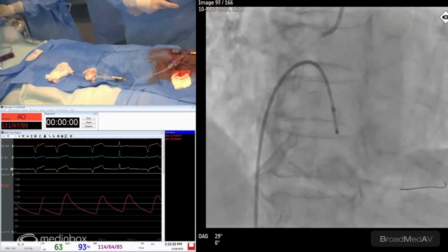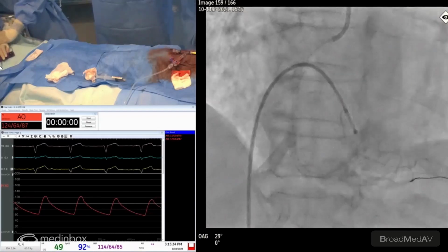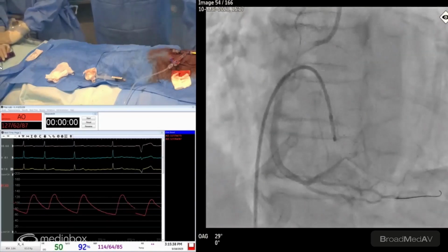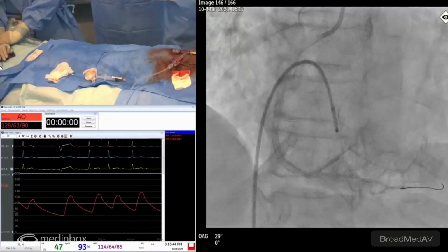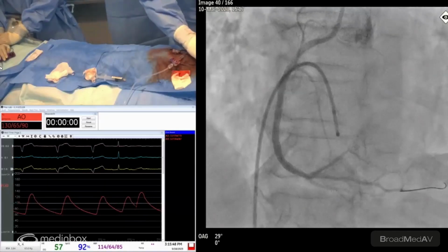Yeah. So what do you think, Guillaume? Is it safe to pull the pacemaker back at this point? So decrease the risk of having perforations? I'm not a big fan of pacemakers, but I don't think I've seen any paced rhythm going in, which goes with the fact that she was a bit bradycardic. Yep. So maybe we can bring back the pacemaker to the IVC.